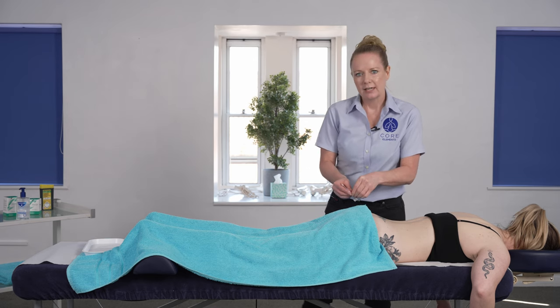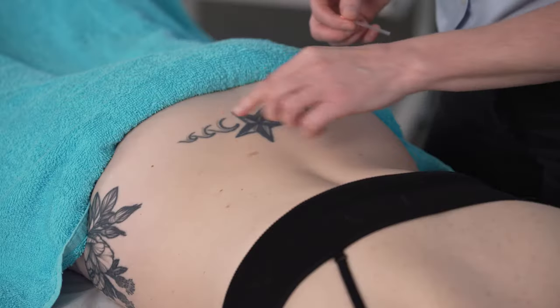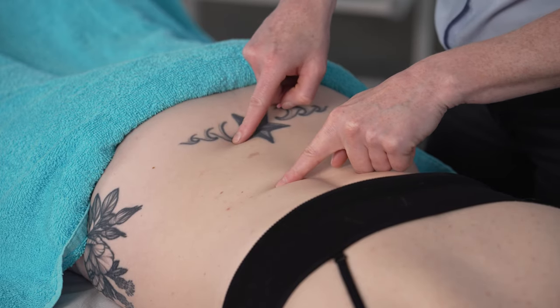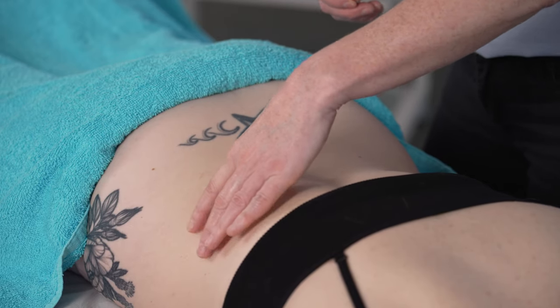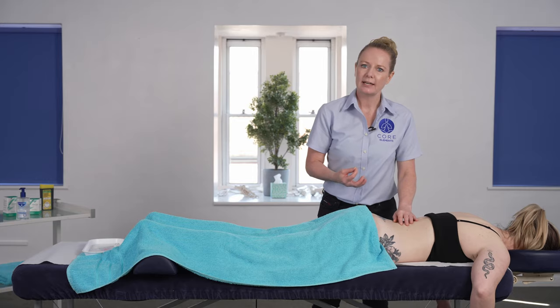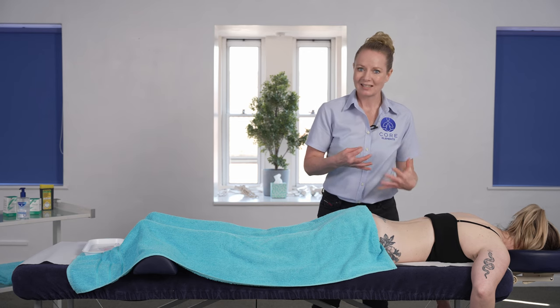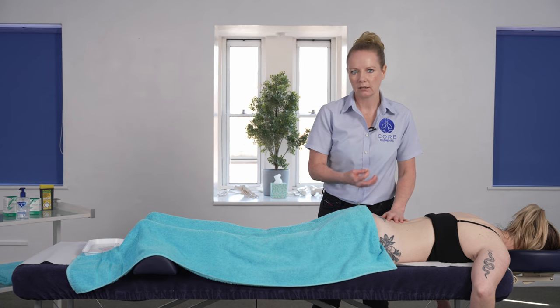The key aim of the needle is that we are penetrating into the muscle tissue. Focusing on that lumbar region and palpating for areas of tension — the key focus with dry needling is that we're palpating for trigger points or muscular tension, and that's going to help you to identify where the needle goes in.